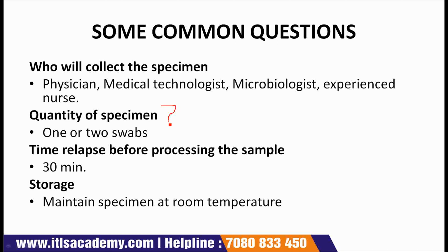Next question arises: what is the quantity of specimen taken from the patient? And the answer is 1 or 2 swabs.